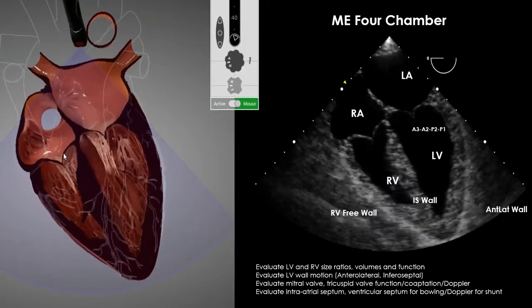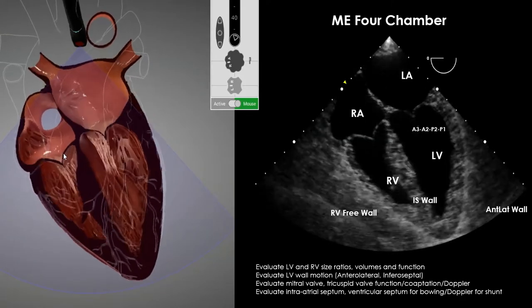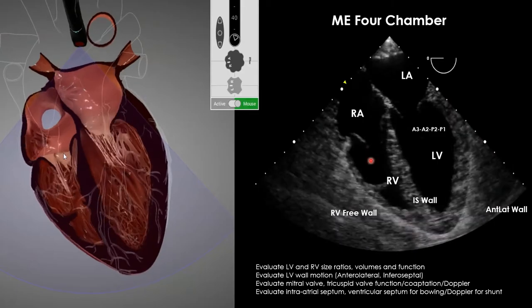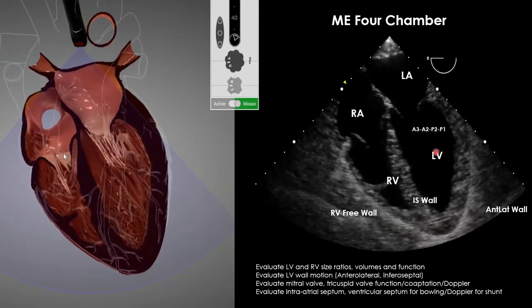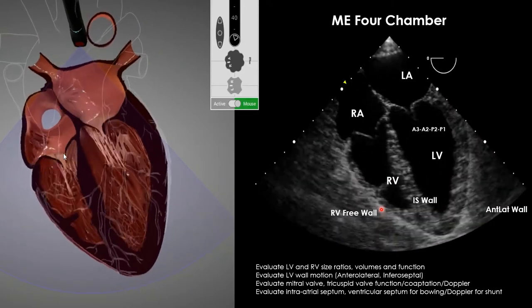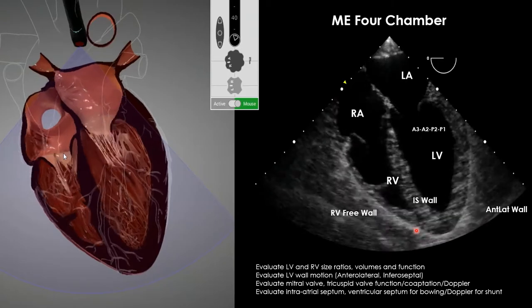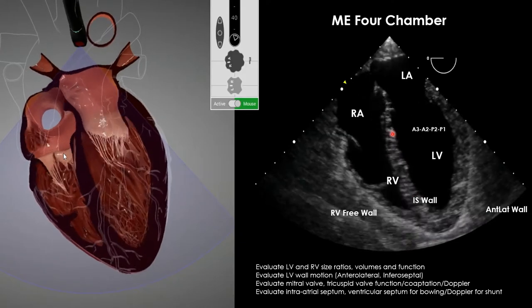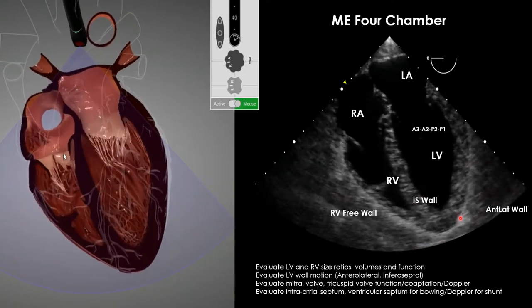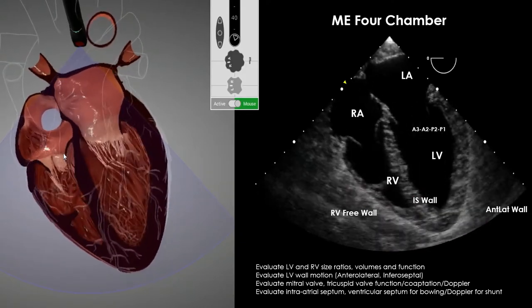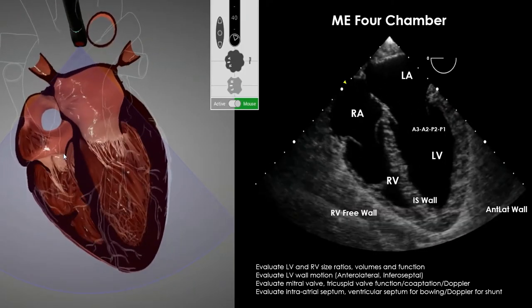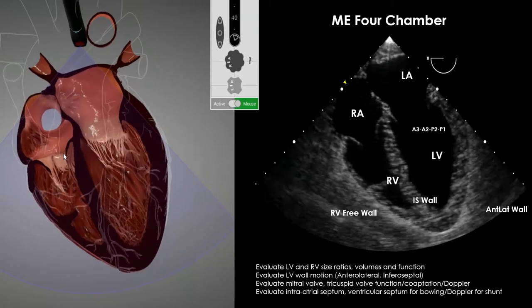The mid-esophageal four-chamber shows LV, RV, left atrium, right atrium — with the RV about half the size of the LV in a normal heart, good wall motion, the infero-septal and anterolateral walls, the intra-atrial and intraventricular septum, and the pericardium. It's very similar to the apical four-chamber on TTE but with better image quality and easier management.